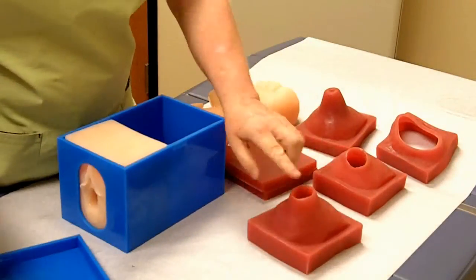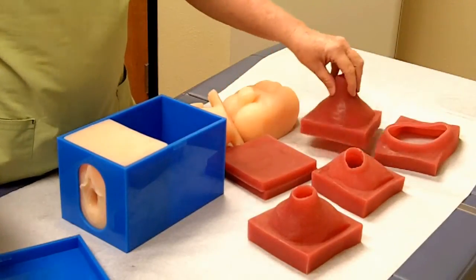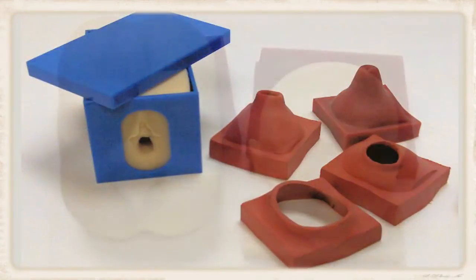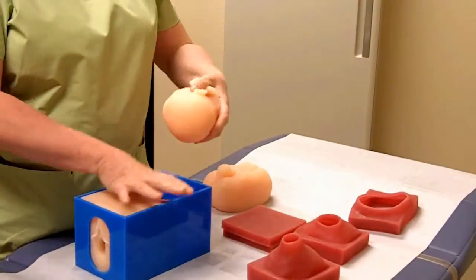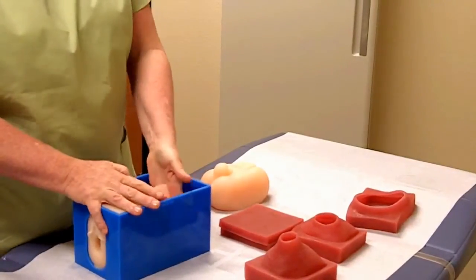As you can see, we have different dilations of the cervix, different effacements, and we have different presenting parts. This is a baby head. This is a male bottom. This is a female bottom.